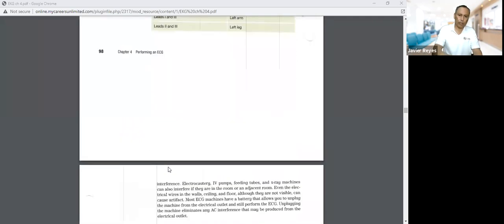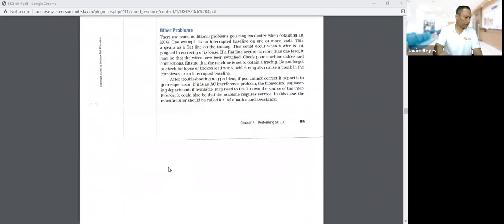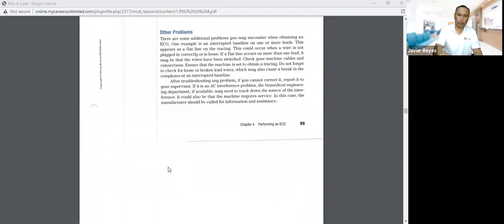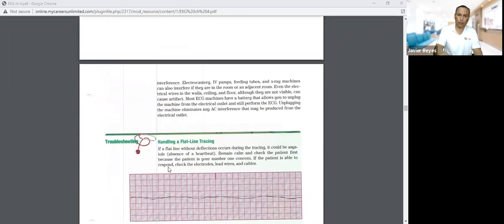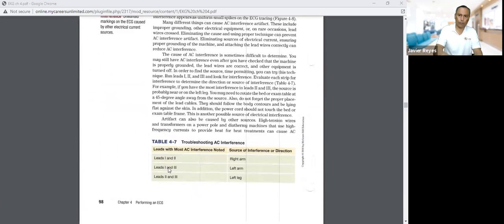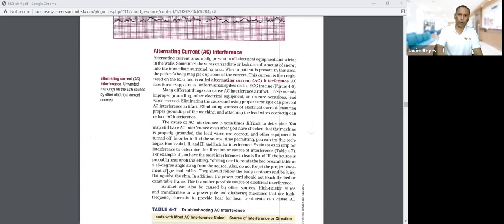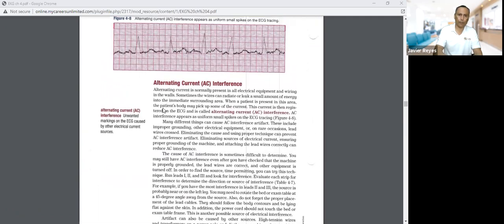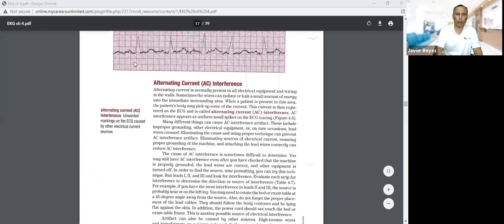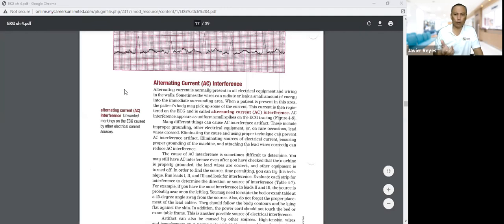AC or electrical current interference. AC, or alternating current interference. We see this a lot. You see how these squiggly lines, all these black marks, all you see is the R wave. Okay, you want to make sure you see the P, Q, R, S, T, and all that. This is not good, obviously. That's just what we call noise or artifact.